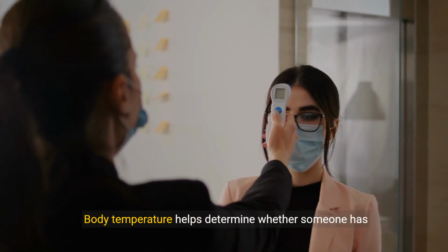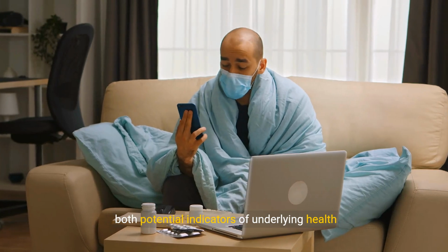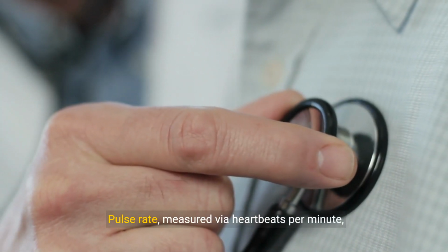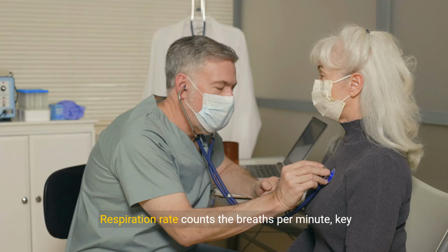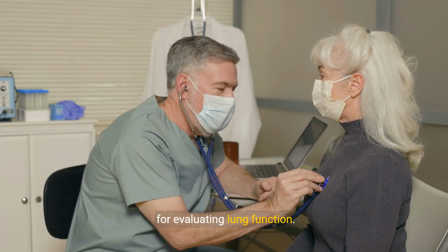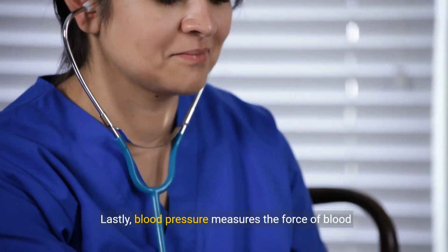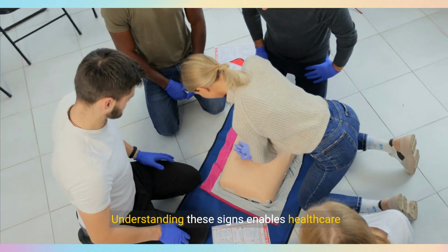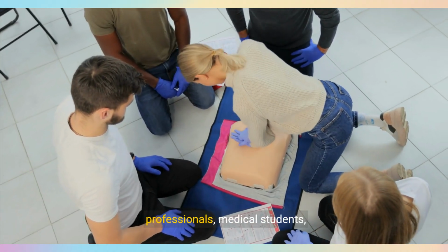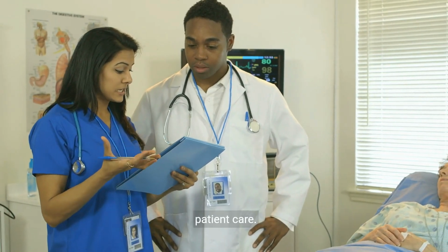Body temperature helps determine whether someone has a fever or hypothermia, both potential indicators of underlying health issues. Pulse rate, measured via heartbeats per minute, offers insights into heart health and circulation. Respiration rate counts the breaths per minute, key for evaluating lung function. Lastly, blood pressure measures the force of blood against artery walls, vital for cardiovascular health. Understanding these signs enables healthcare professionals, medical students, and caregivers to make informed decisions about patient care.